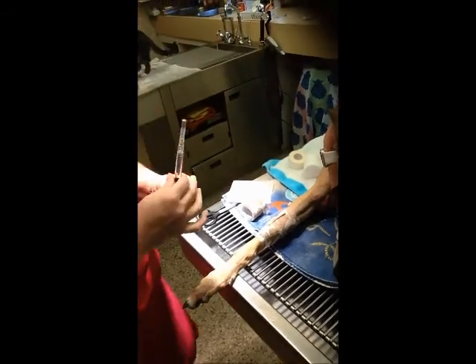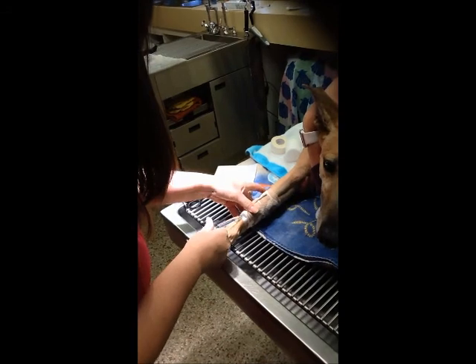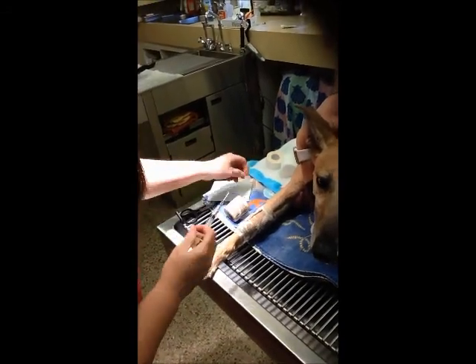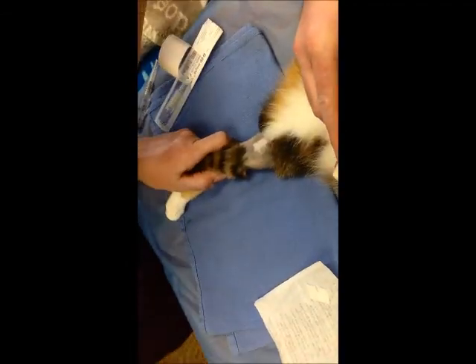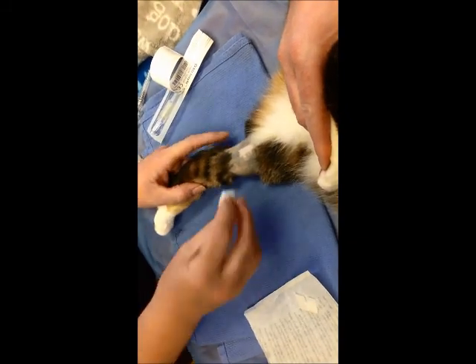And I'm going to get my flush. Good. And put 2 cc's of flush in it. All right, we're going to do a catheter in the medial saphenous.